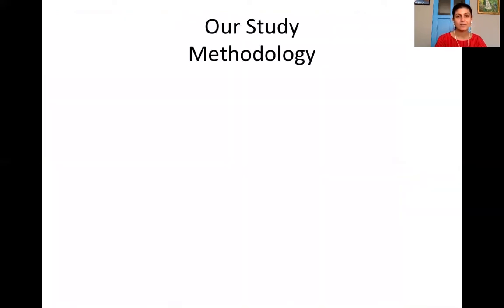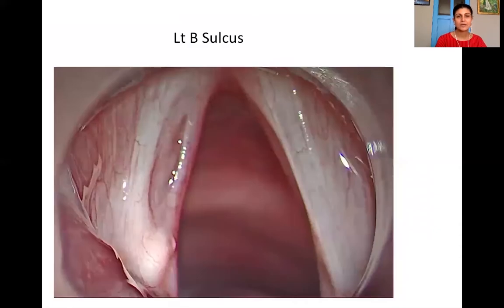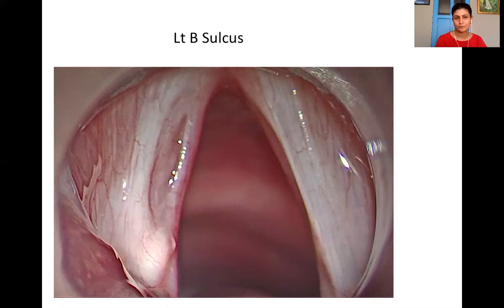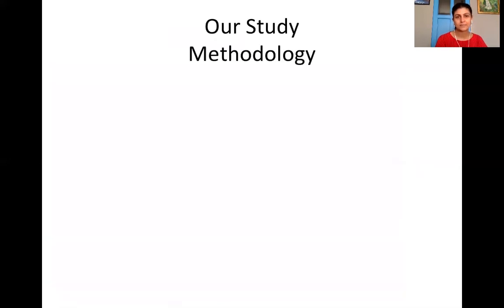Here, however, is a sulcus which would be classified as a left type B sulcus because the length is more than 50% of the vocal fold and the depth is into the ligament.